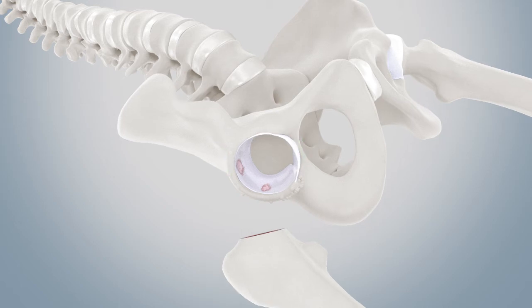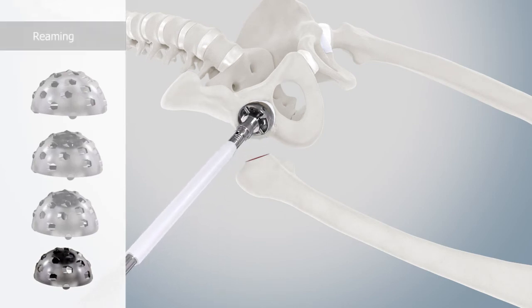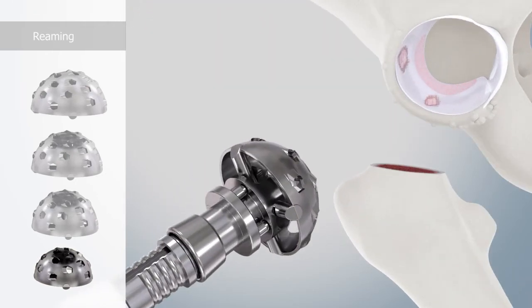Now the bony preparation of the acetabulum is started. The implantation depth and center of rotation are first defined by reaming medial with a small reamer whose diameter is selected at least 3 to 4 numbers smaller than the preoperatively planned target size. The acetabular fossa can serve as a landmark here. Once this is done, the acetabulum is only widened further with increasing reamer diameters.